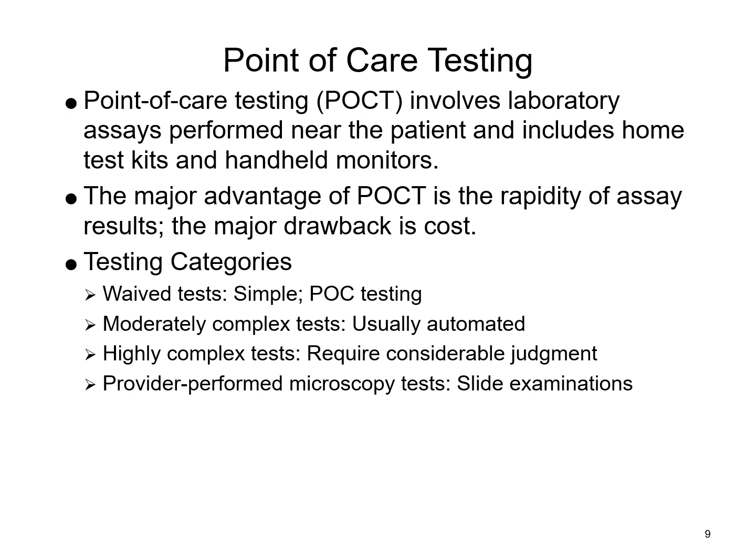So some of these larger facilities looked at bringing on automated testing versus those point of care test kits. This helps speed up the process as well as lowering costs, because you're running a big batch at one point versus someone having to set over a point of care test kit and watch it and tend to it.